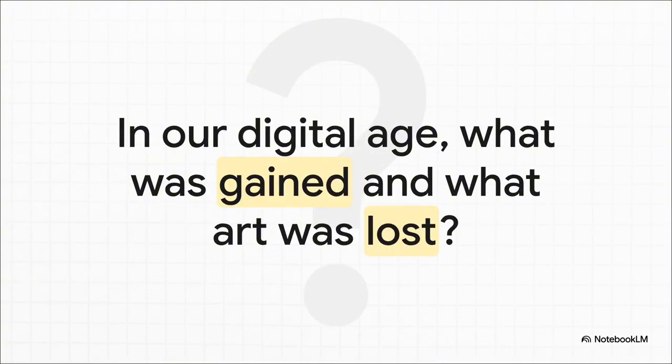And really, that brings us to a final thought. This whole complicated hands-on process, this chemical dance, this used to be the absolute peak of technology. Now, of course, we have digital sensors that give us an image instantly, with way less work and less radiation. It's so much better for everyone. But it does make you wonder, doesn't it? In our huge leap forward in convenience and speed, what have we gained? And what kind of artistry have we maybe lost along the way?